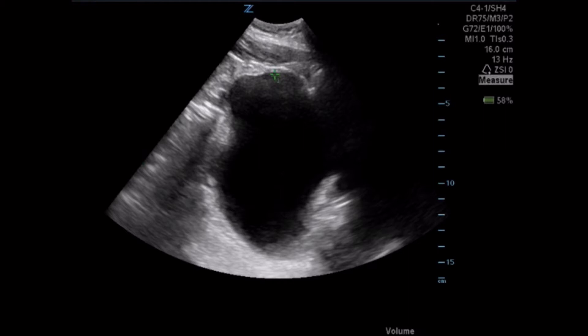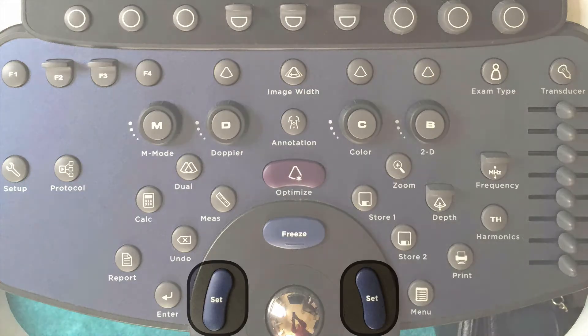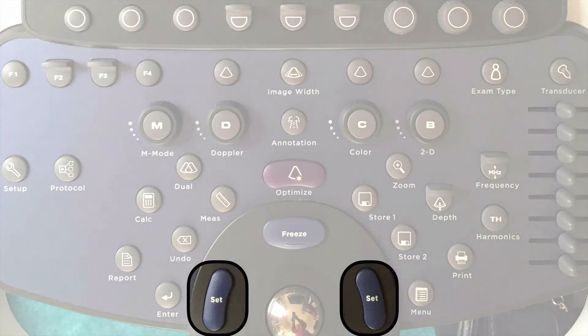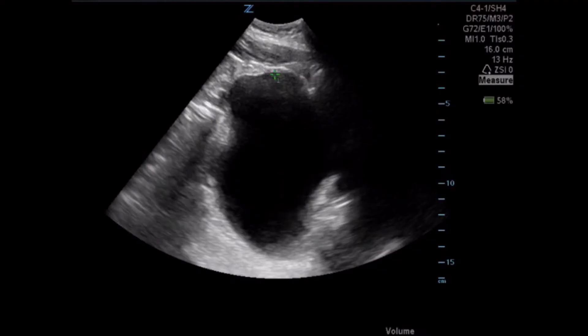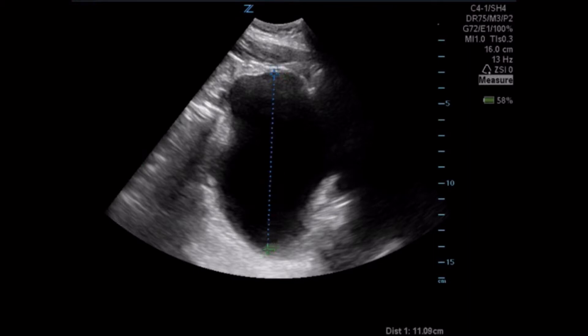You can see that caliper is set to measurement one. To do the measurement, you're going to press the set key, which changes the caliper from green to blue and anchors it, so that you can then drag that caliper over to get measurement one, which is in our anterior to posterior plane.